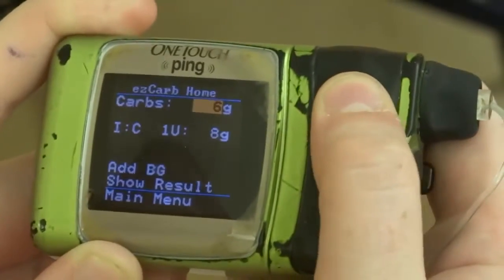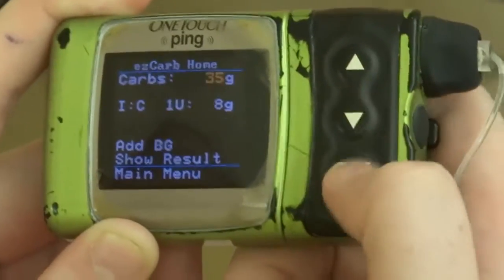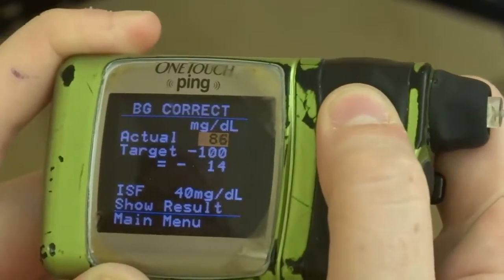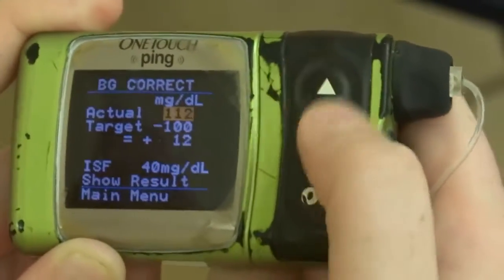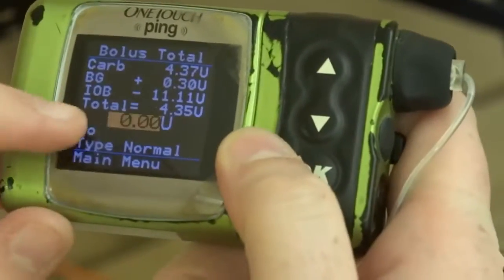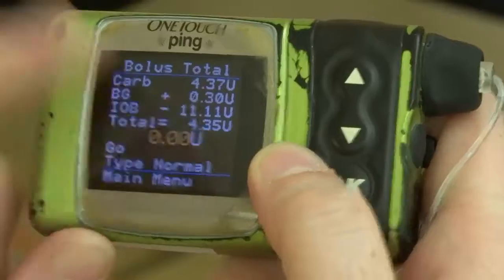You can put in how many carbs. Say I had 35 carbs for breakfast, then go down to add blood sugar — my blood sugar was, let's say, 112. Press okay and then show result, and it's going to show you in total how much it wants you to take.